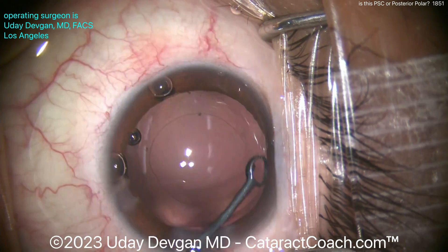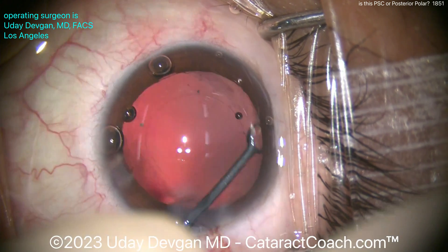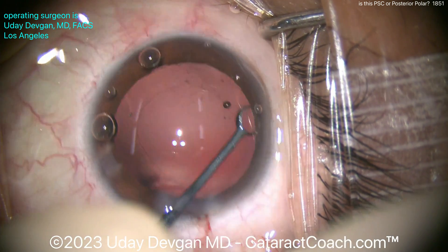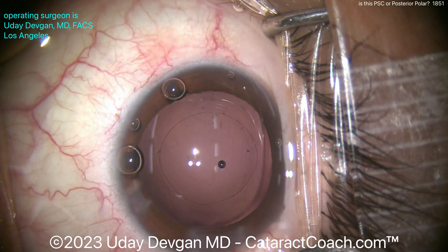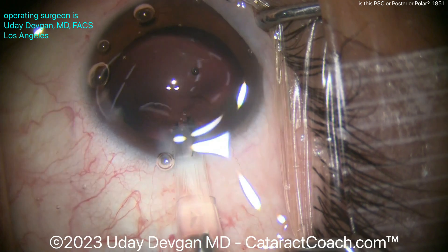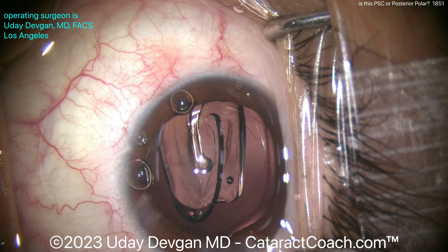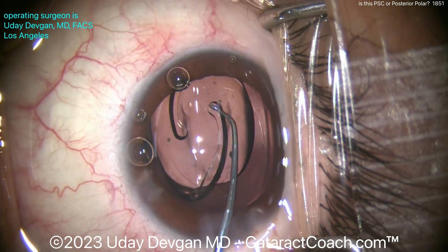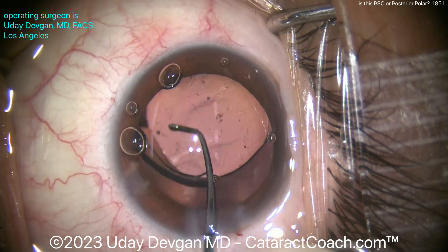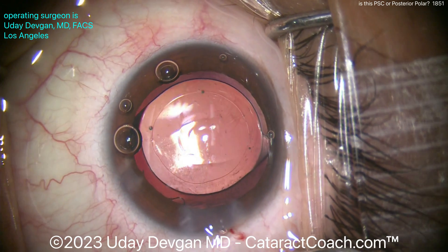That cleaned up nicely. We're even going to polish the undersurface of the anterior capsule rim — why not? Polishing up the undersurface is pretty clean; not really much going on there. Now let's get the lens in. You have an option: you could put in a single-piece acrylic in the bag, which is what I'm going to do, but you could also use a three-piece lens to have more options just in case there's an issue with the capsule bag. There's the lens going inside. Let's get it nicely opened and positioned — you can see it really is a 5mm rhexis with a nice overlap of the optic.